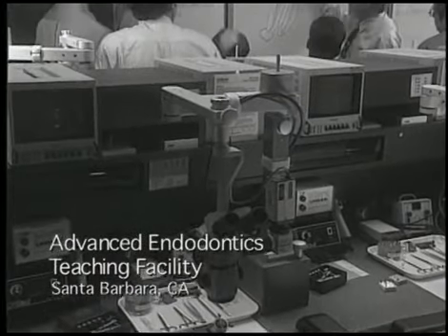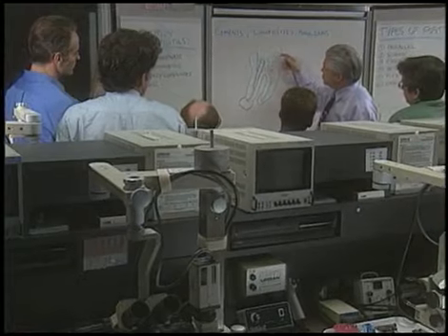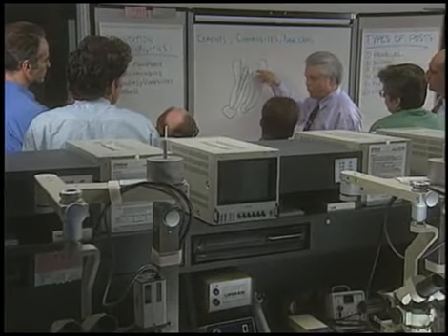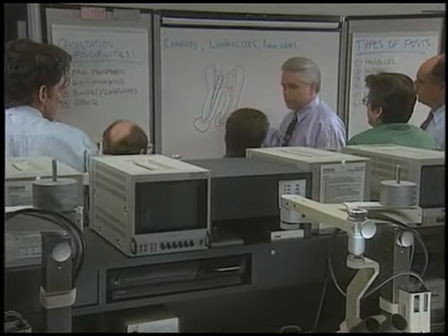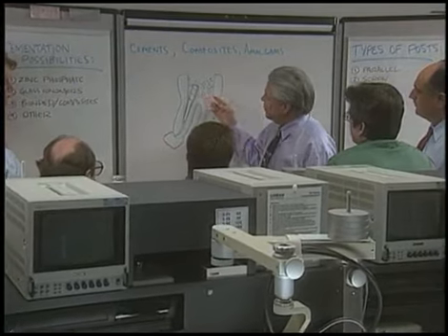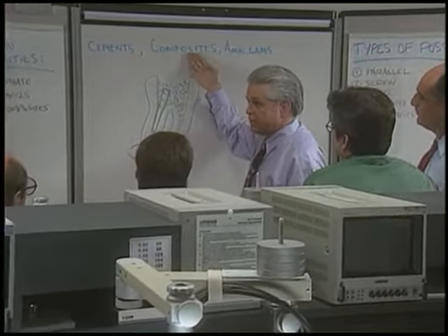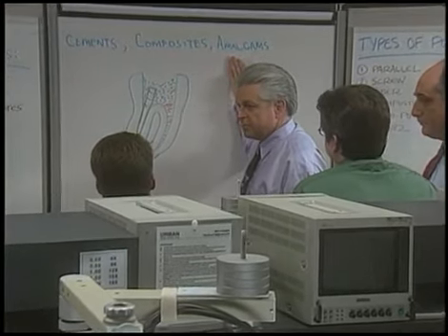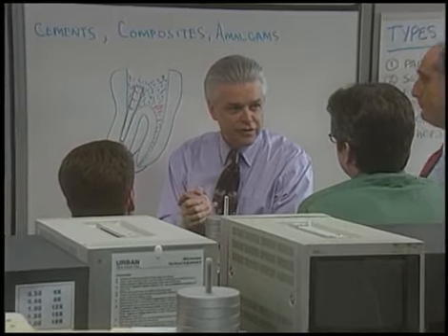So great access is critically important in endodontic success. It is essential that we carefully remove all the restorative materials to free up the post to facilitate its subsequent removal. Remember, during access and re-entry procedures, you're going to encounter cements, composites, amalgams. Okay, let's get started, and let's head back to our workstations.